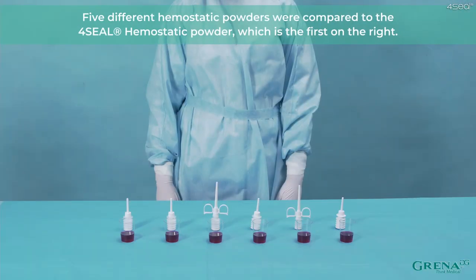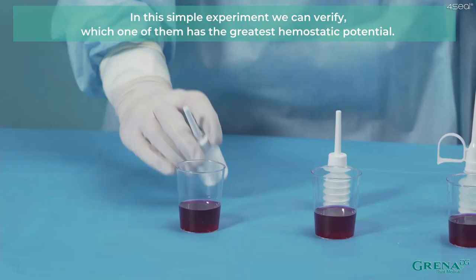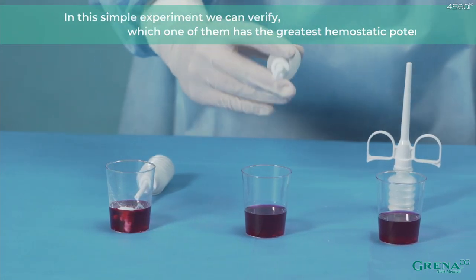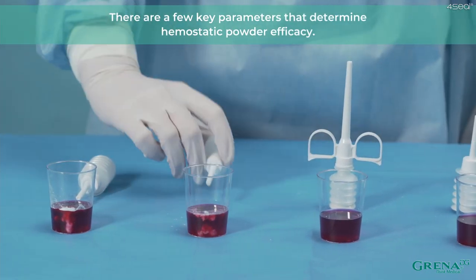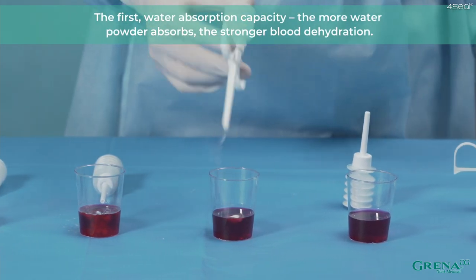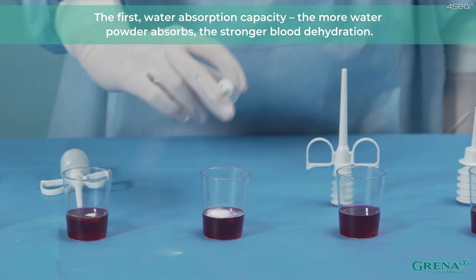5 different hemostatic powders were compared to 4Seal Hemostatic Powder, which is the first on the right. In this simple experiment, we can verify which one of them has the greatest hemostatic potential. There are a few key parameters that determine hemostatic powder efficacy. The first is water absorption capacity — the more water the powder absorbs, the stronger the blood dehydration. The second is water absorption rate — the quicker the powder absorbs water, the faster the hemostatic effect.